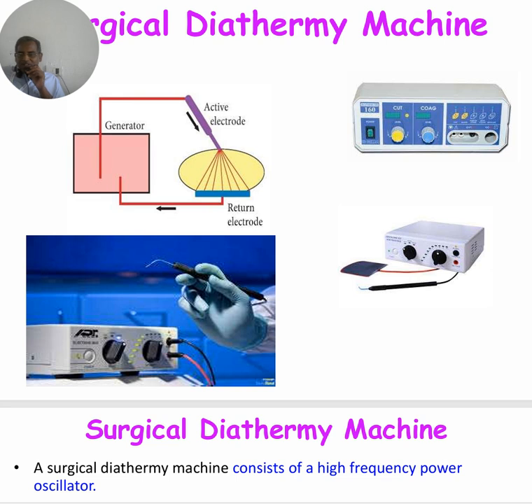In the previous video we have seen the principles of diathermy. In continuation, we are going to explain the surgical diathermy machine: what is the function of the surgical diathermy machine in the surgery.